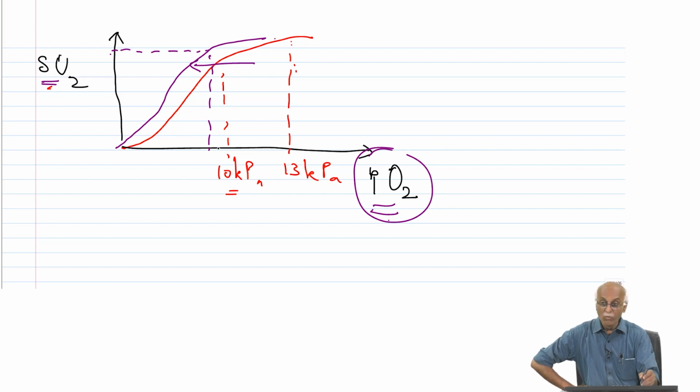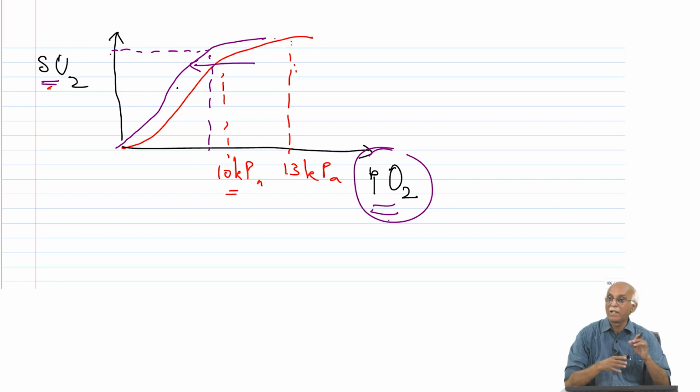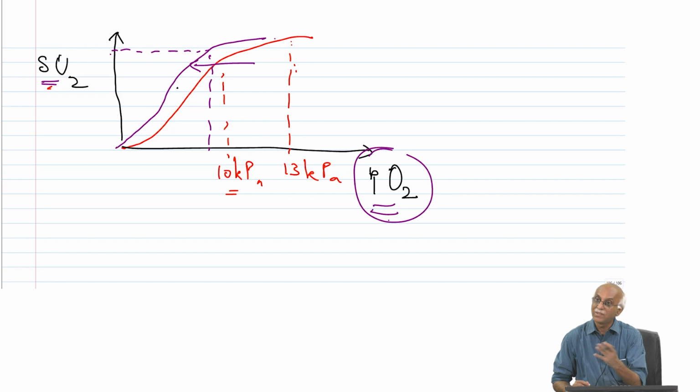So, how will we capture such information? In conventional pulse oximetry we cannot capture this information, and we need something more, because then we should know how to capture the carboxyhemoglobin value. So, that is one idea, one challenge: how can we capture carboxyhemoglobin with this instrument simultaneously and correct the saturation parameter accordingly.